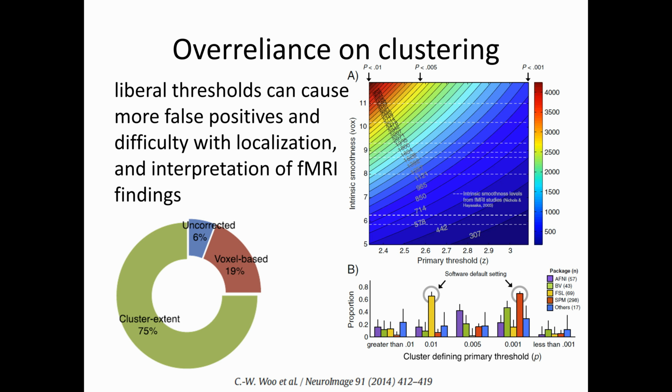Okay, so with all these things in light, people went, clustering, great. There's a warm, happy place for the future of imaging. And with the clustering, it was that sort of approach where you adjust your voxel-based p-value and you adjust your cluster-level p-value. There is a lot of wiggle room. As you can see by a chart here, we've got smooth data, and you adjust your cluster size, and you adjust your p-value, and you can wiggle things around. And there's a number of significant results that you can end up with picking.